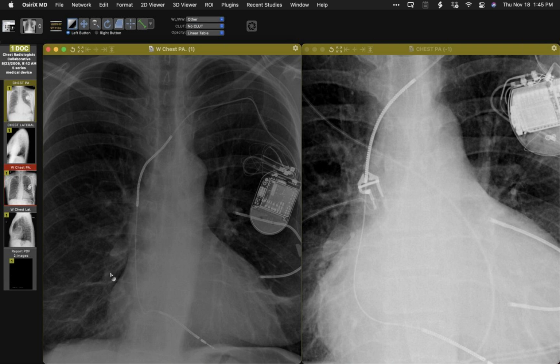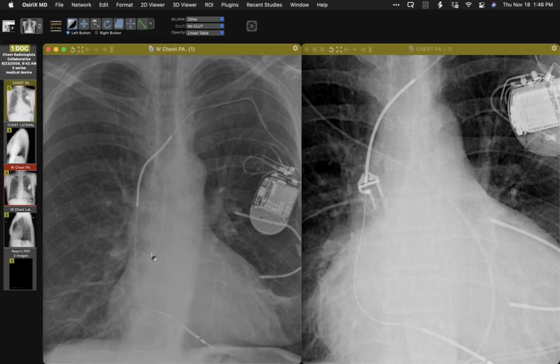Presumably, there are still maybe some patients out there with the lead in place that have a broken lead, but no one has discovered that because they're not symptomatic, or they're not followed up closely, and telemetry is not done to necessarily evaluate the leads. Some patients will be lost to follow up, so there are probably some finite number of people that still have this particular lead in. So we might see that on occasion going forward, but I don't know about the number of leads that were implanted before they stopped being manufactured and distributed.